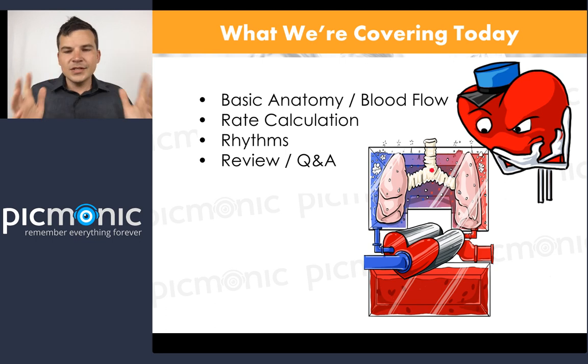And I know all the instructors out there, they say concept, concept, concept. But in reality, that's really difficult to kind of grasp. Well, what is the concept? Well, we're going to go over concepts of this stuff today. We're going to go over how to calculate the rate in a very crude, rudimentary form, and then we're going to jump into some rhythms.